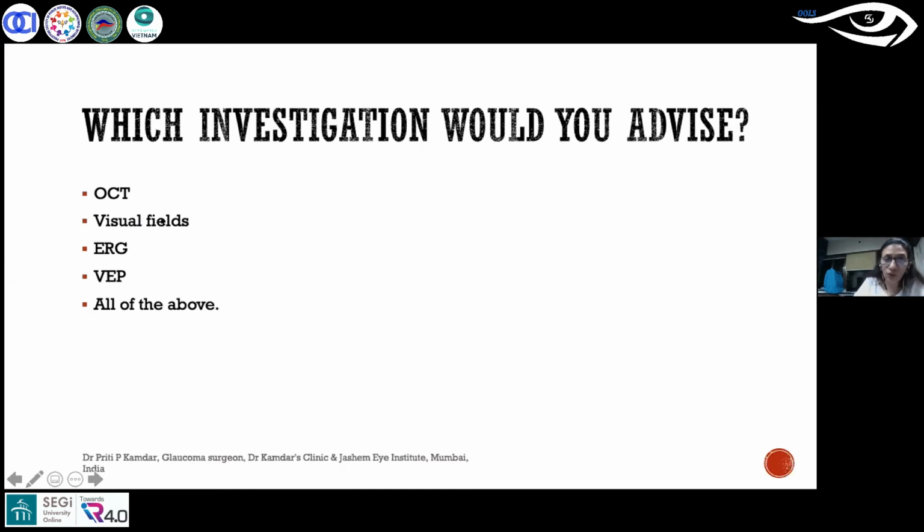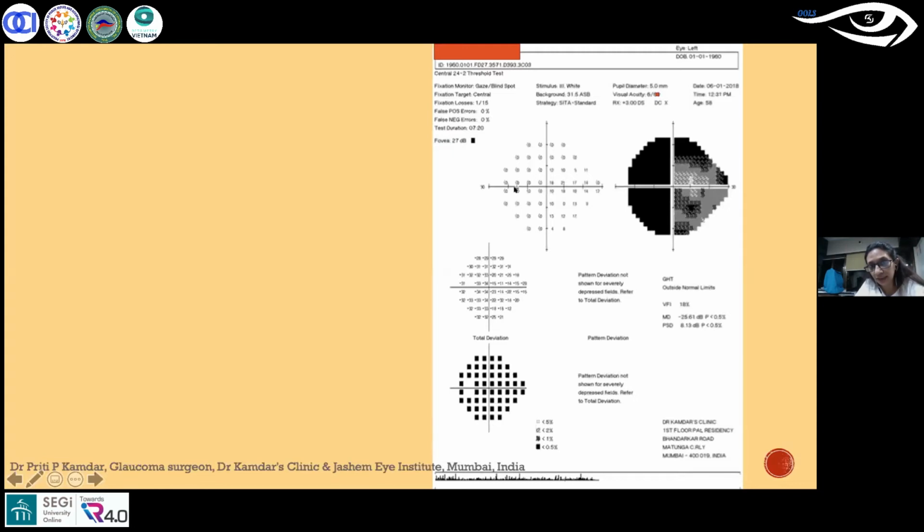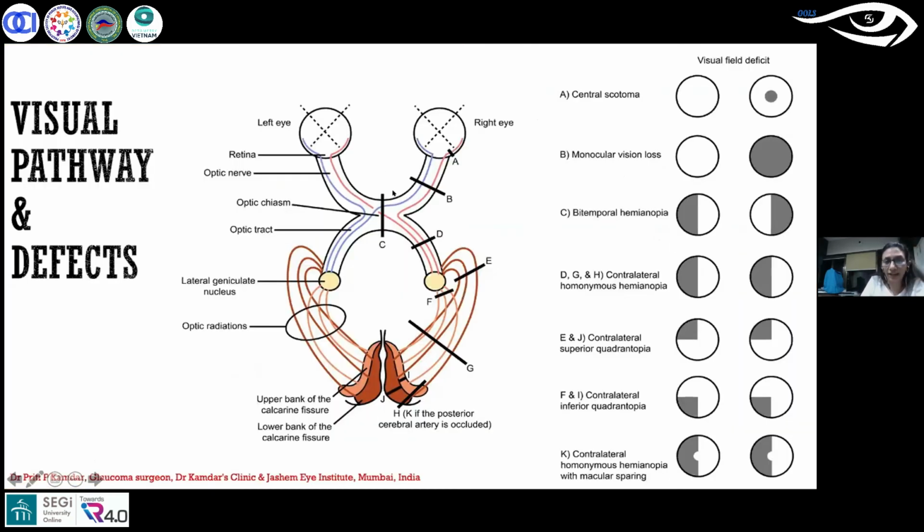Now what I did is I did only the fields. I got to know that if you see, this is the blind spot and the temporal field is damaged more than the nasal field. So it means that there is something going on at the level of the pituitary. Some of you might ask why did one eye become completely no PL and the other eye still has vision? So let me go back to this diagram, and I'll tell you that here this was a sphenoidal ridge meningioma. And what is a sphenoidal ridge meningioma? What it does is, in a pituitary tumor, it affects the center of this crossing. So both the nerves get affected to the same degree.